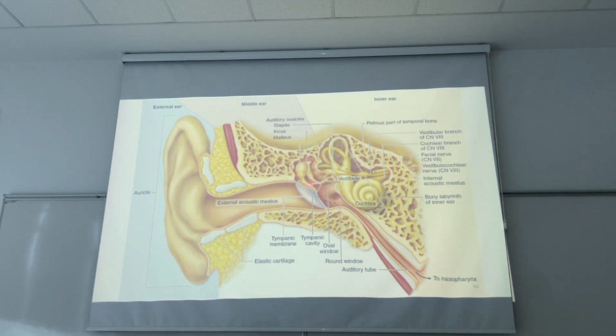In the middle ear we have these three ossicles. The malleus is connected with the tympanic membrane and, at its other head, connected with the incus, which continues with the stapes. And the voices from this tympanic membrane are changed into mechanical force and continue through the bones to the vestibular window or oval window in this part. Here is the beginning of the internal ear.